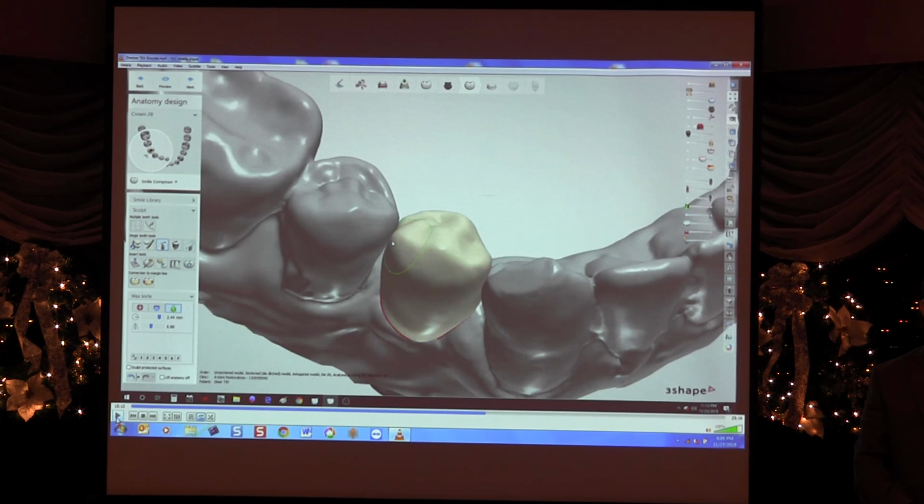So that's where we start getting to the models. He says, Craig, the last 7 crowns, they're perfect, Shuaib. But why am I even sending you a model? So we do see modelless cases now. We're not going to see modelless dentistry for a long time, but we do see modelless cases, and more are asking for modelless cases. Does it save money? It might save money. Is it bragging rights? It's kind of bragging rights, but it streamlines everything for all of us, doesn't it?